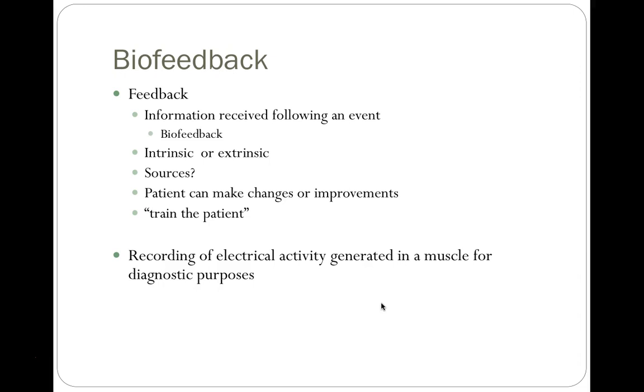And we're using this for diagnostic purposes, right? We're trying to make interpretation from the electrical activity to the amount of motor neurons being stimulated in the muscle that we are targeting, in order to help train the individual to contract that muscle more completely. And so what we're going to get as a readout of this is what we call an electromyogram, which is a representation of the activity.